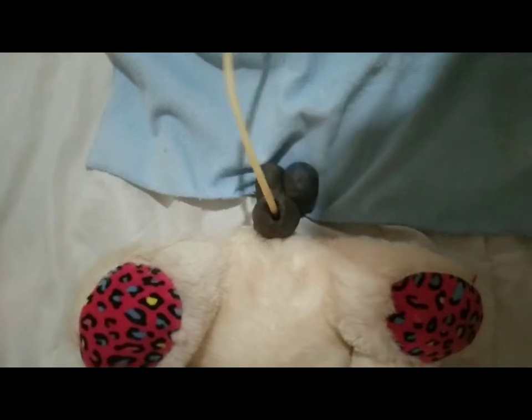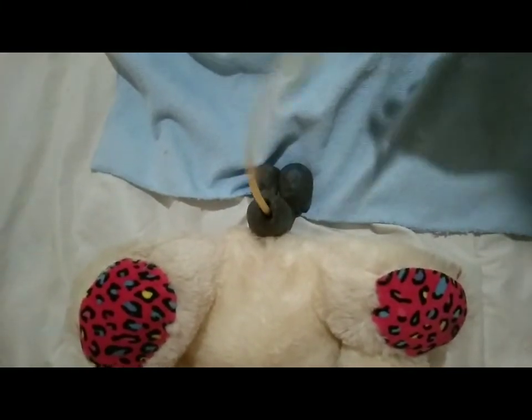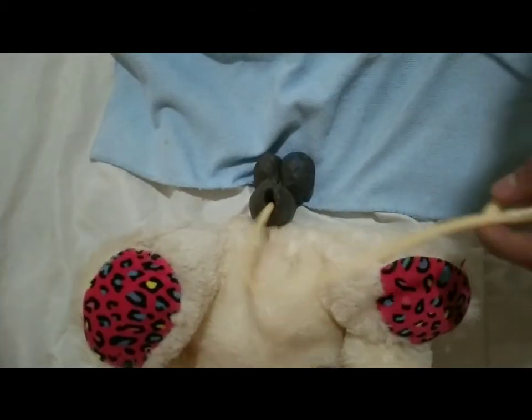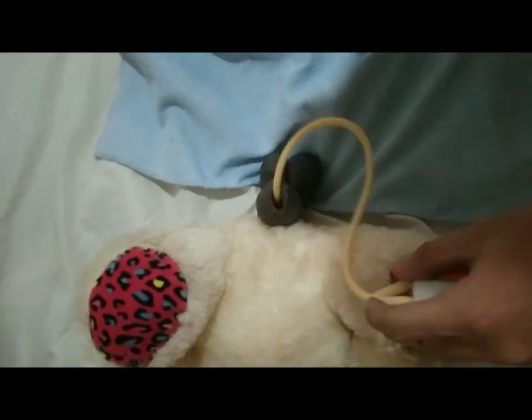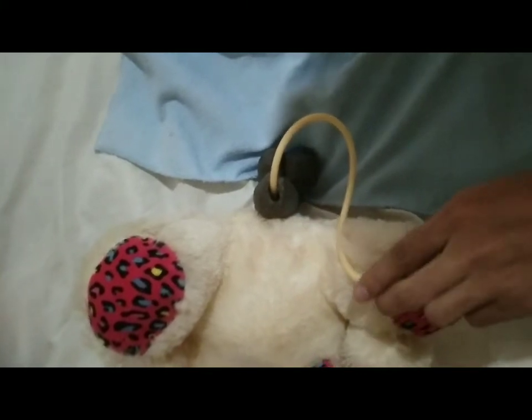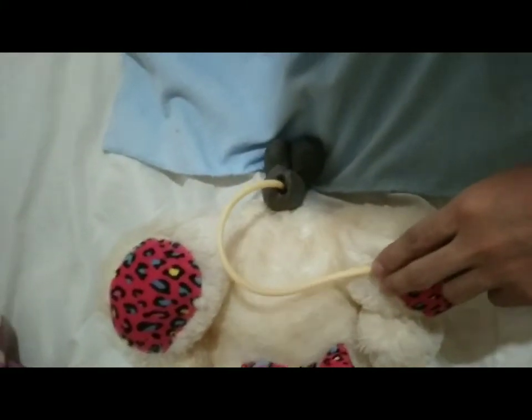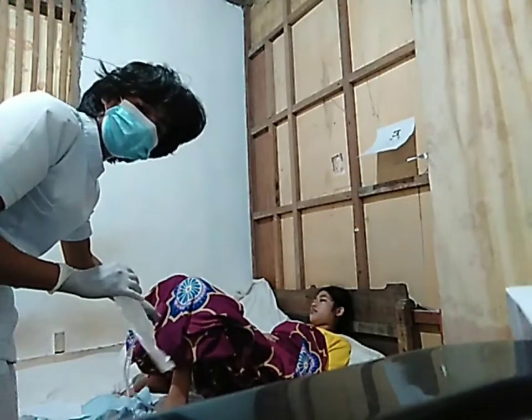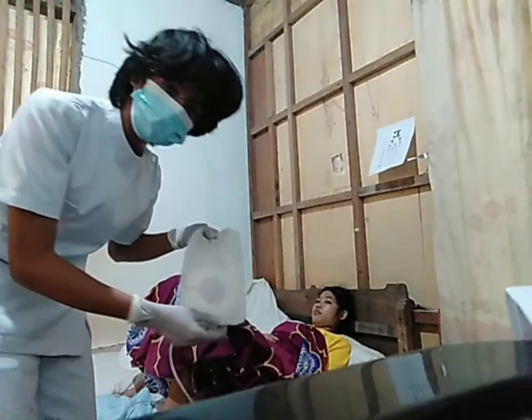So next, we are now done injecting the water, and now we will position the patient. We will tape the catheter on the left leg side of the patient so that it won't move. So okay, we are now done with the insertion. Now we will place the tubing, and we can tape it on the leg part of the patient so that the catheter won't move.